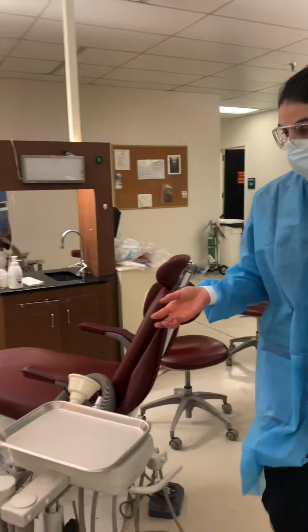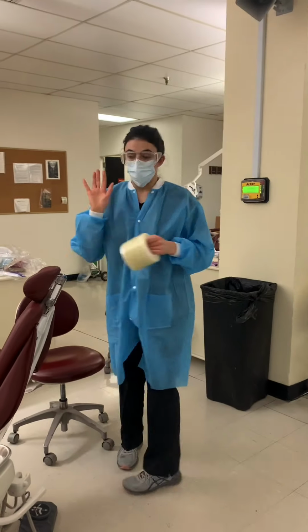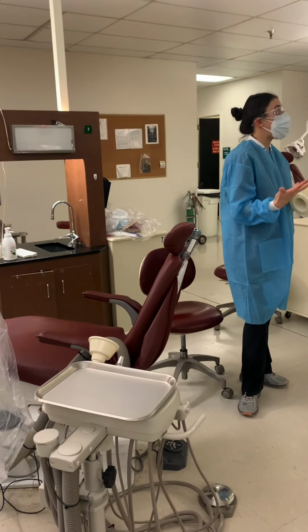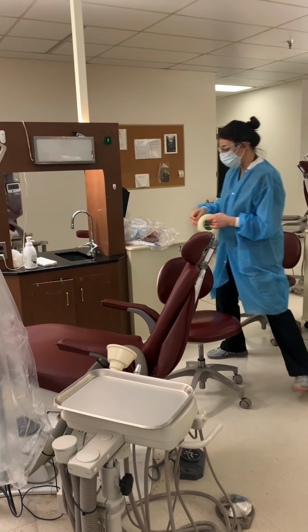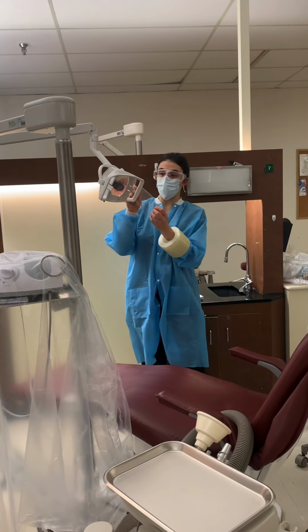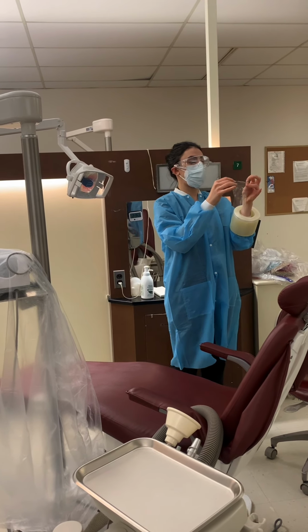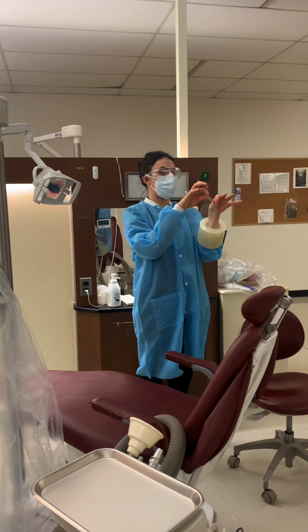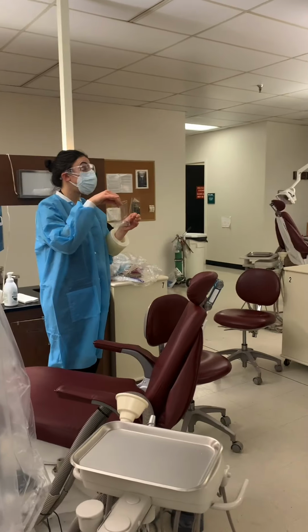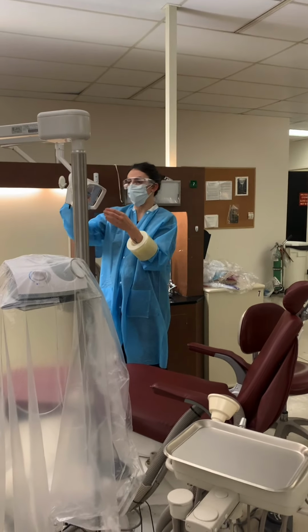So one of the most commonly used barriers is barrier tape. We're going to tape all the surfaces that we have that are high touch surfaces. So for example, the light. One thing to remember when you are putting barrier tape on the handles is to give yourself a little bit of a lip here with the barrier tape because it will make it easier to take off. Because sometimes when it grips onto itself, it's like a war to get it off.